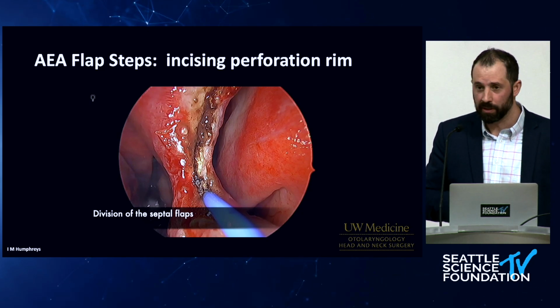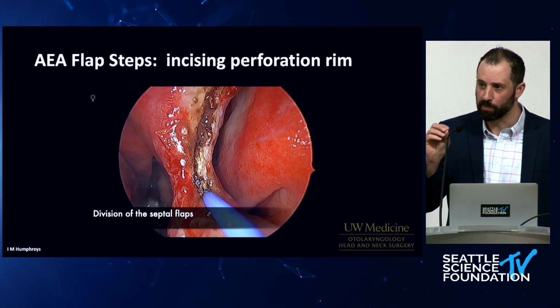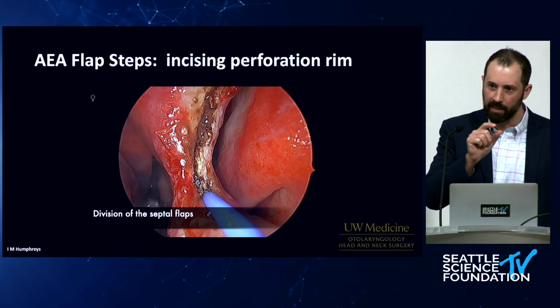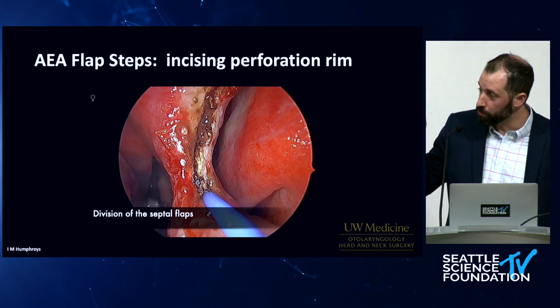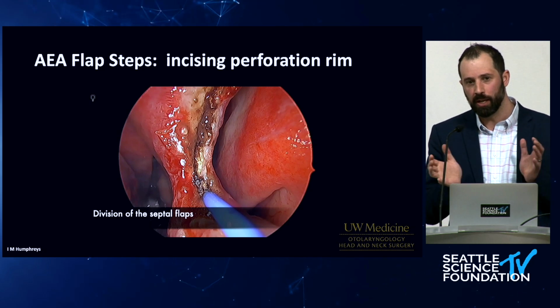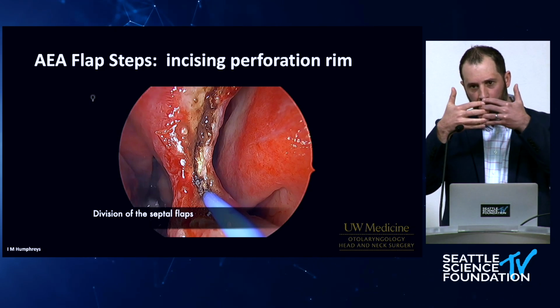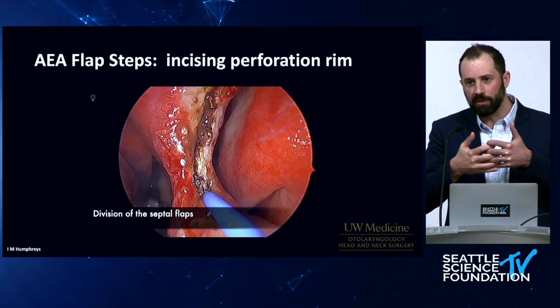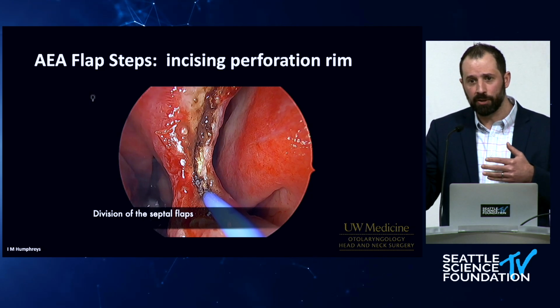It first begins with identification of the anterior septal perforation. Again, we're selecting smaller anterior septal perforations in that 1 to 3 centimeter category. They tend to be circular to ovoid in shape. The first thing we want to do is identify the edges. Once septal perforations have matured, the mucoperichondrial flaps or mucosal edges come over and attach in a scarring fashion, which essentially creates a fistula inside the septum of the nose. We need to separate that; that is the first step.